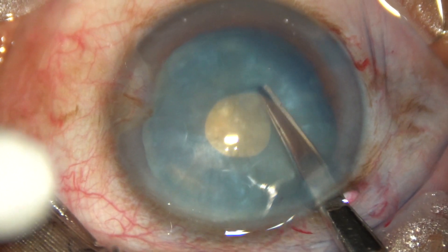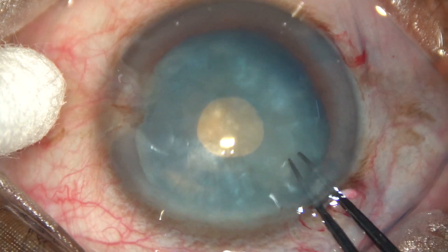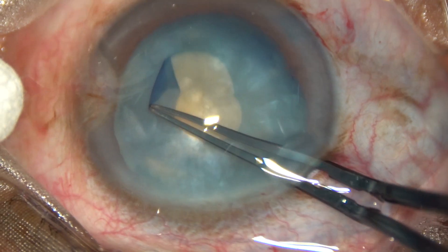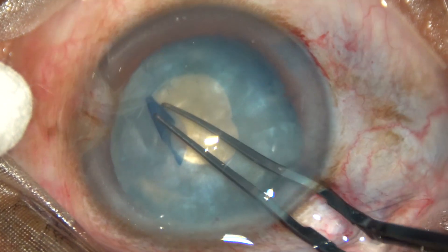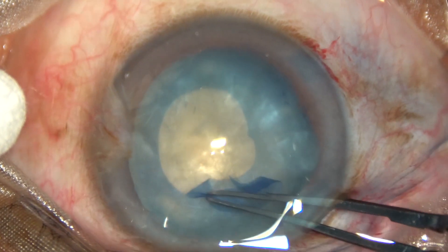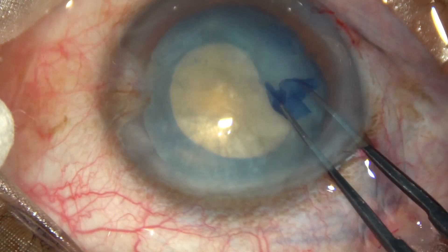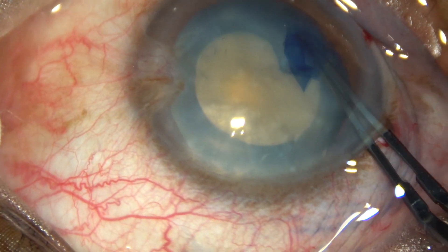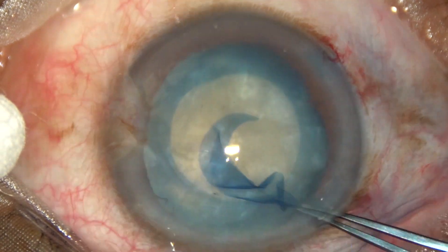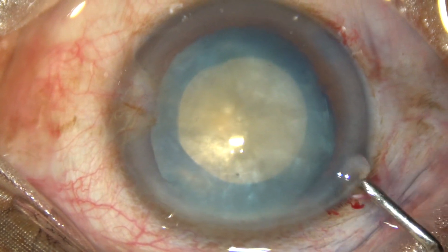Use a Vannas scissor to make a cut at the margin of the rexis. It should not be a radial cut — it should be an oblique cut. Enlarge this rexis into an optimum-sized capsulorhexis of 5 mm or 5.5 mm. In hard cataracts, you can make a rexis of even 6 mm.